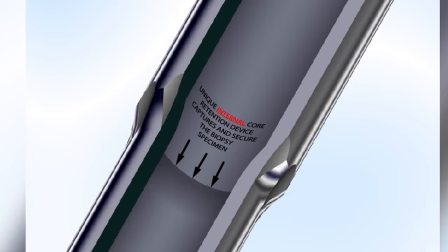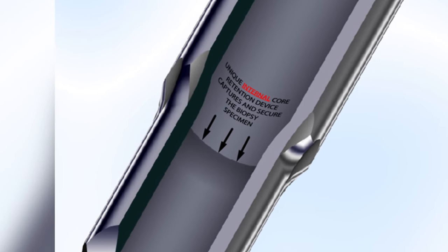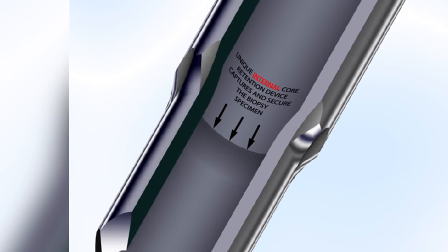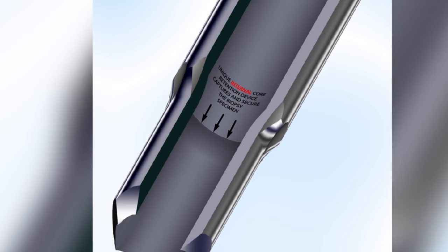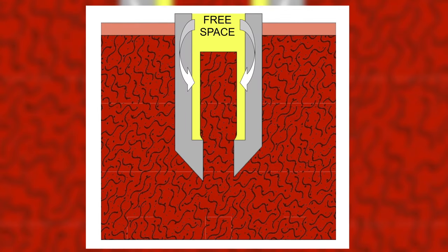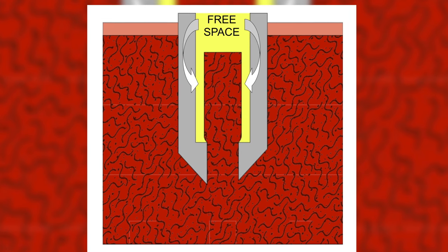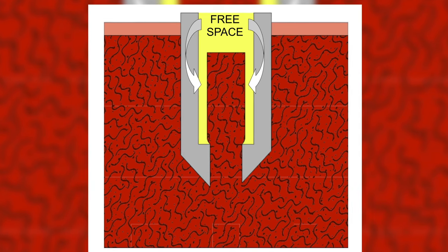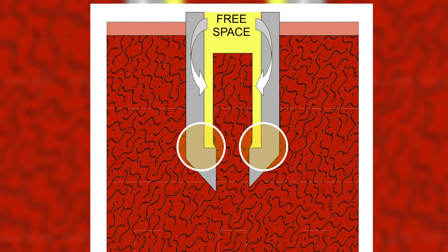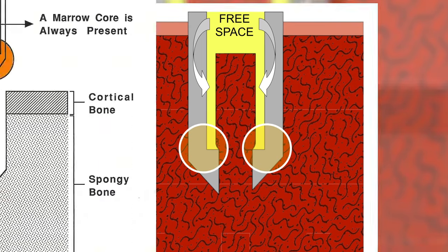One of the most important features of this needle is the carefully tooled distal cutting end of the needle with this internal core retention device. As a result, when the biopsies enter into the hollow needle, it cannot slip out. As the biopsy enters into the hollow needle, it expands to some extent in the free space within the lumen of the needle. This internal step acts as a shoulder and prevents the biopsy specimen from slipping out of the needle during its withdrawal from the patient's body.